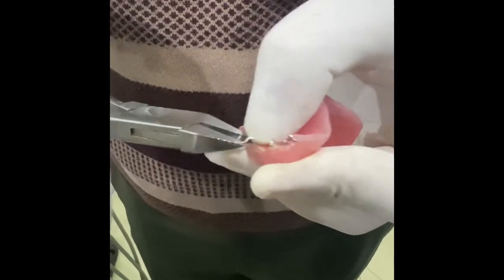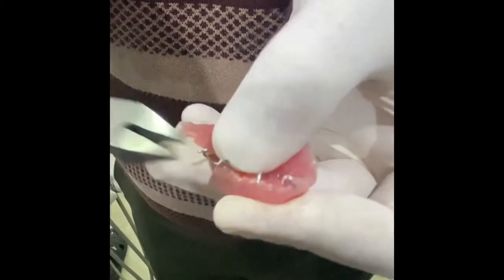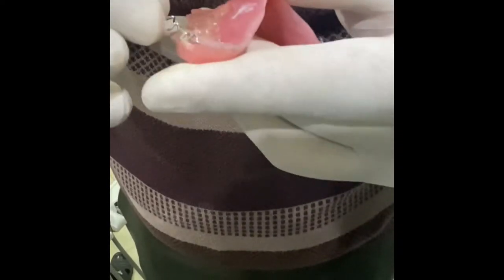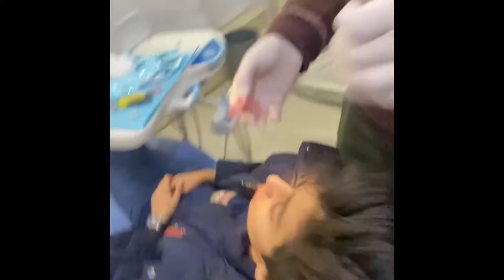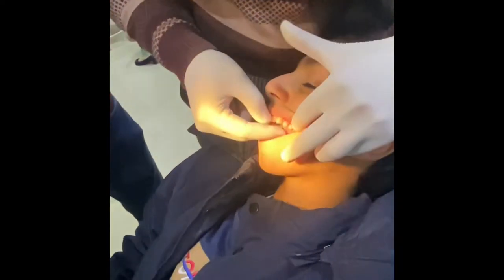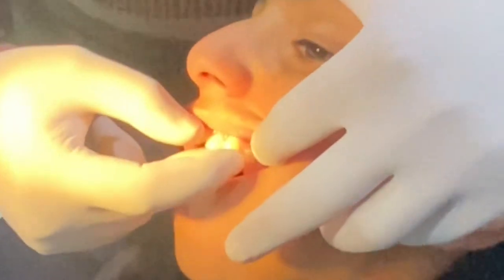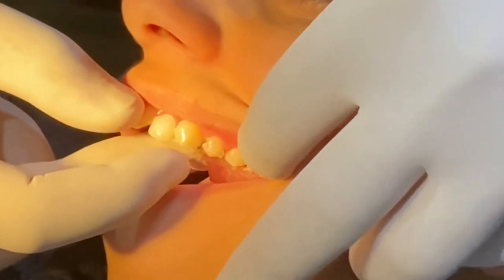We can cut this. Now you have the place for the tube, but this may interfere with the wire. So this needs to be pressed down.